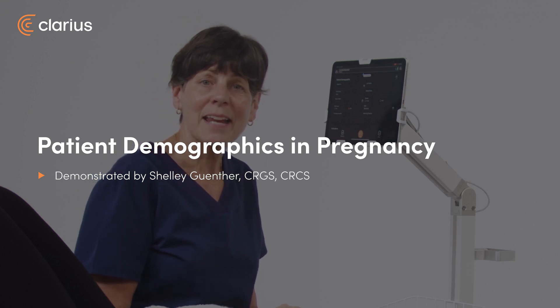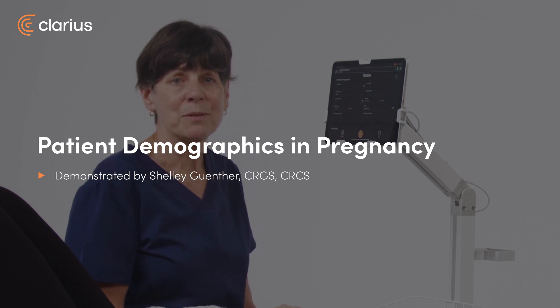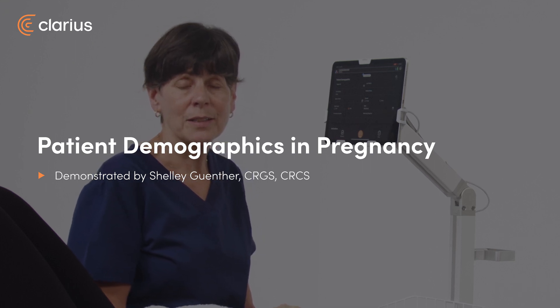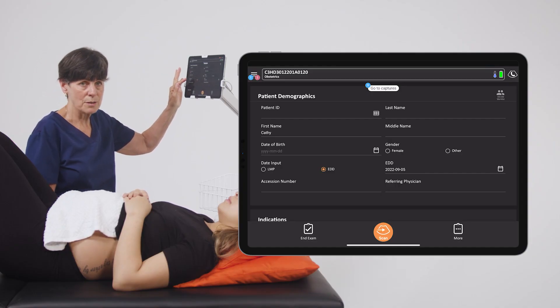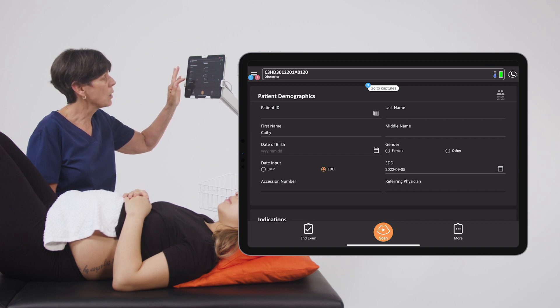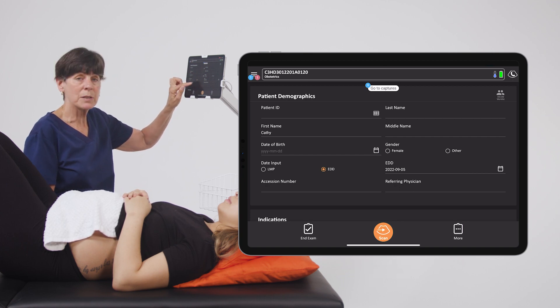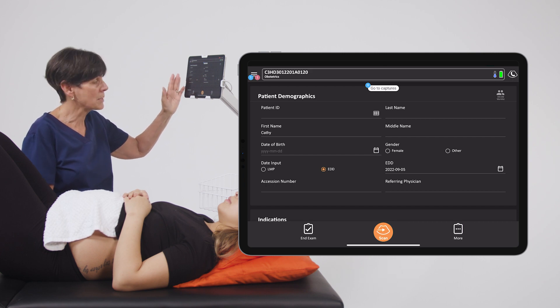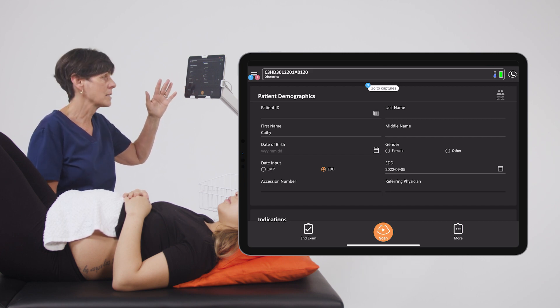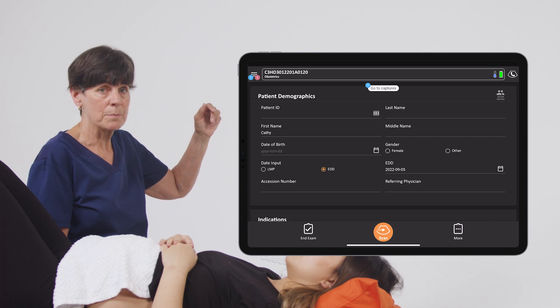Hi, my name is Shelley and today I'm going to show you the options available to you on the patient demographics page, in particular for your pregnant patients. On this page you can enter patient name, ID, gender, date of birth, etc. But you also have the ability to enter LMP or estimated due date, which will be really important if you're doing measurements of the baby and need an estimated fetal age or weight.